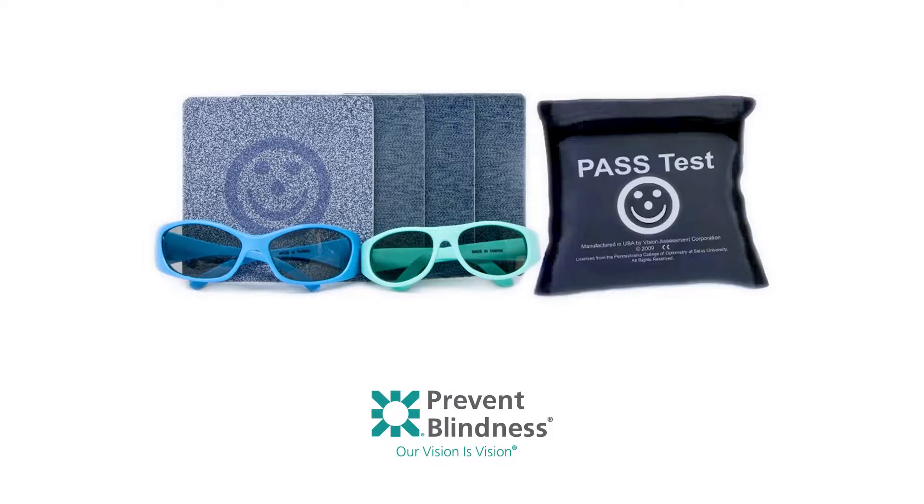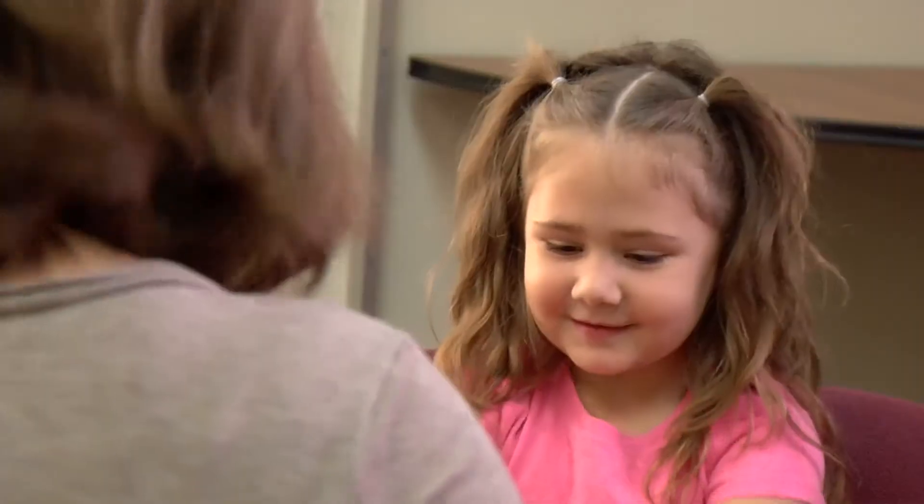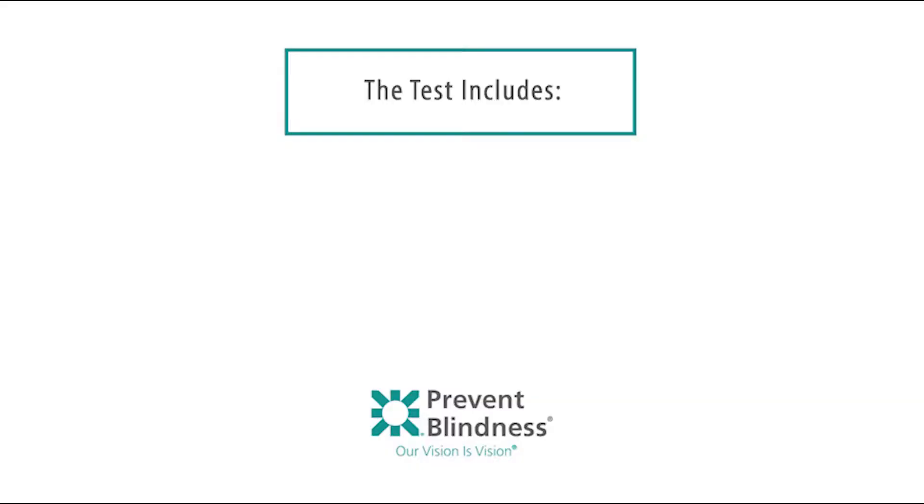The PASS 2 test is used because it performs better than other commercially available tests of stereoacuity based on scientific literature. It is a depth perception test designed for assessment of stereopsis in children and non-readers to check how well a child's two eyes work together. The test includes four cards.